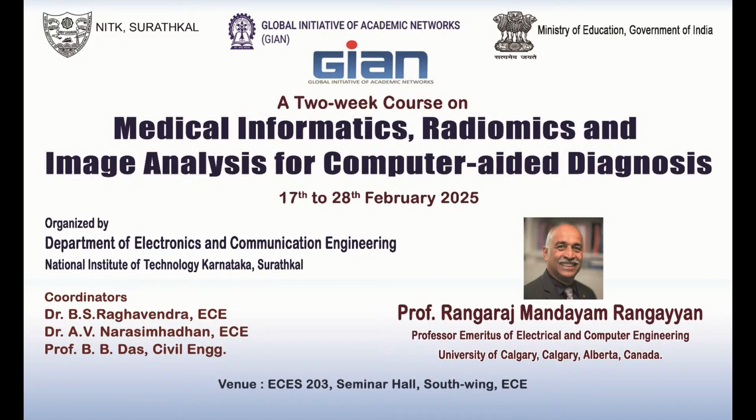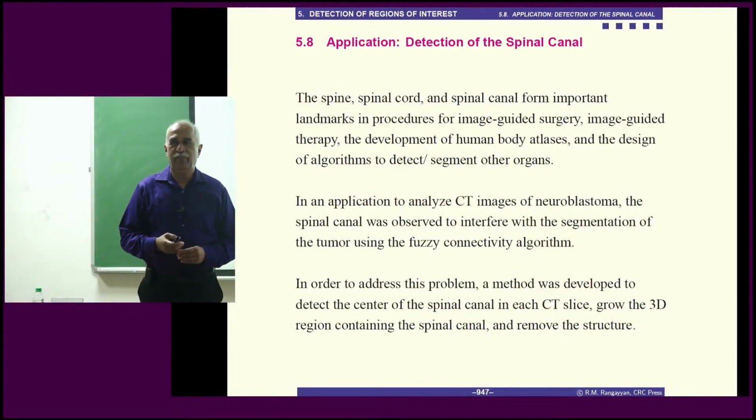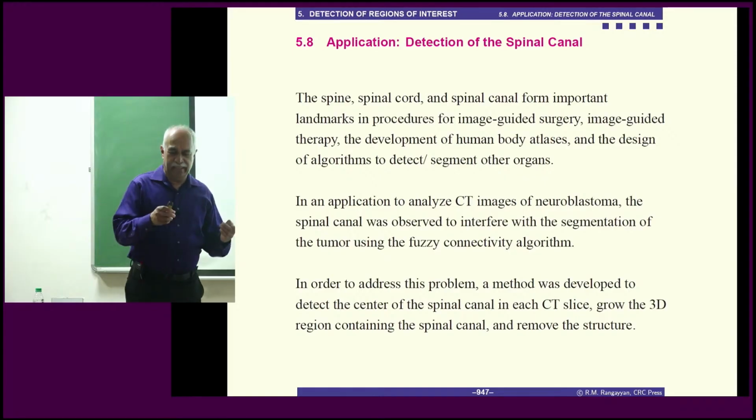Let us look at a few applications that we have worked on from our own research projects. We will look at detection of the spinal canal, and this will come up a little later in my seminar on 3D image processing for landmarking. I'll show some of this again later.